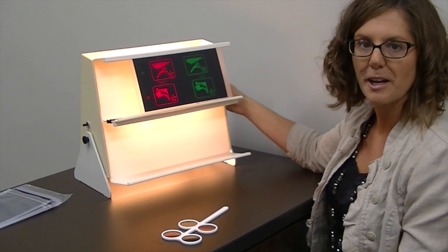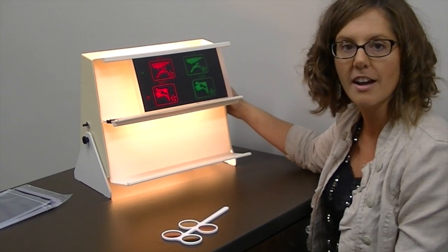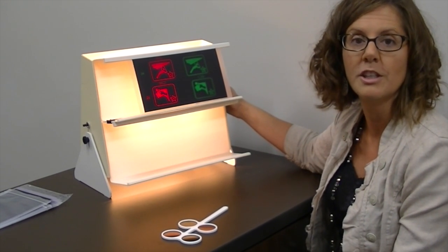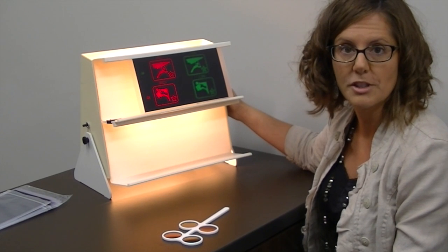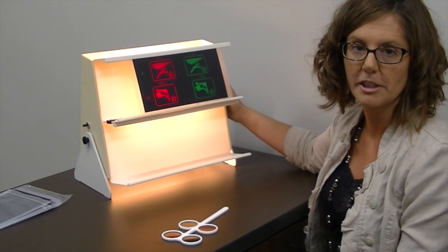This instrument is called a vectogram and it specifically works on how we align our eyes, either to converge which is to cross our eyes, or to uncross our eyes which is called divergence. That is a very important task that we should be able to do very easily.